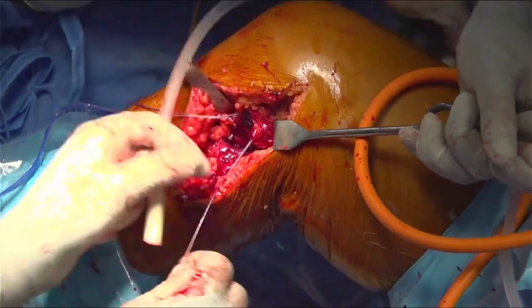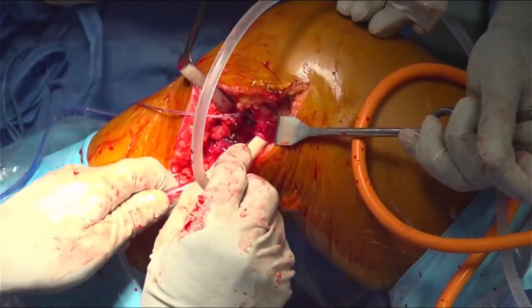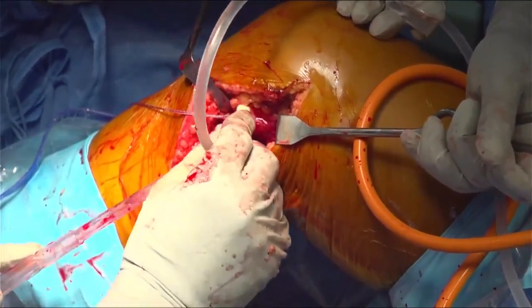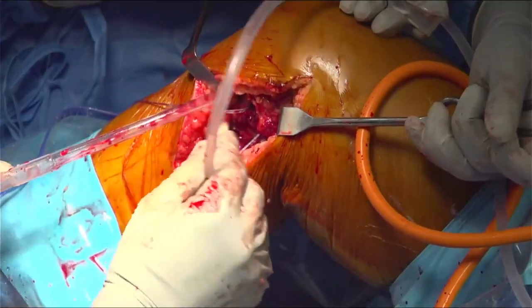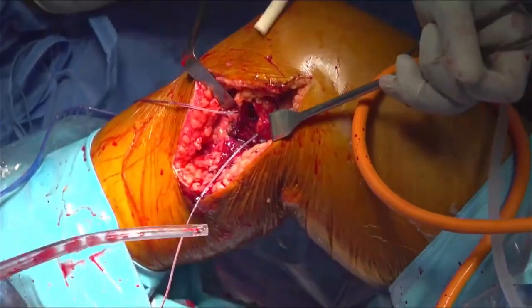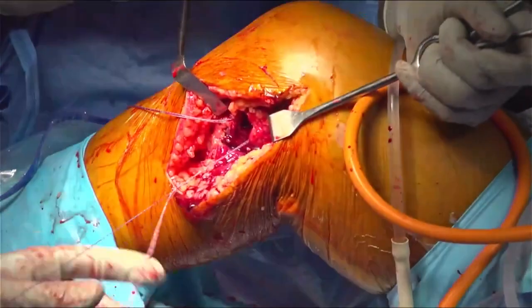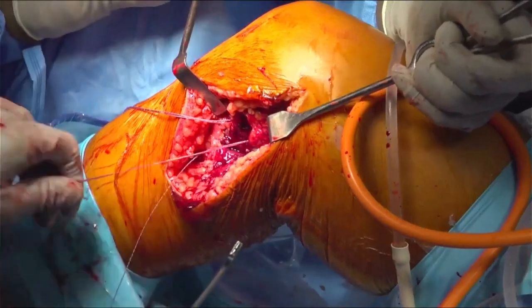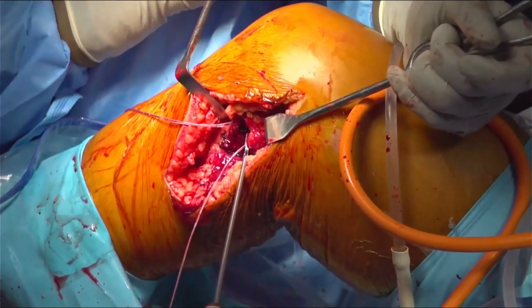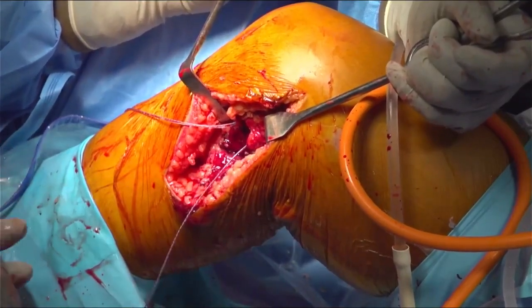First pass, stop. So now we will be using the first pass ST. First pass ST please.